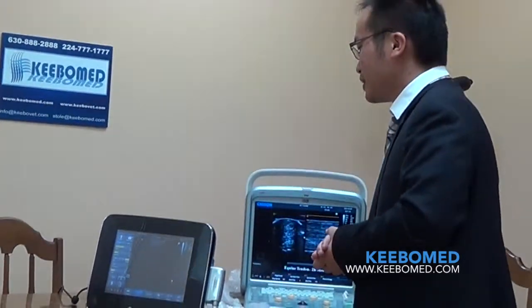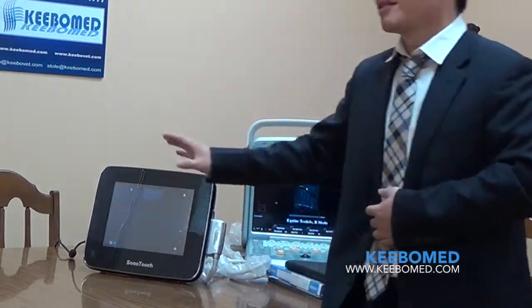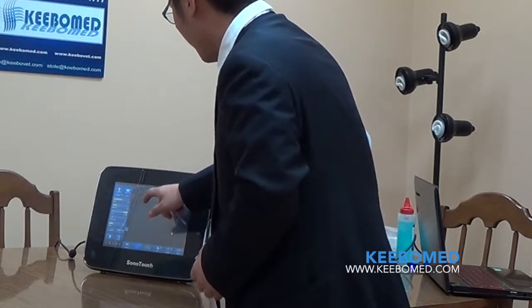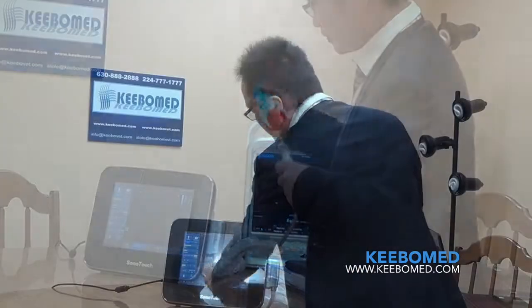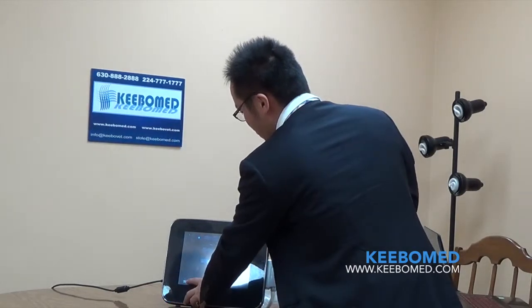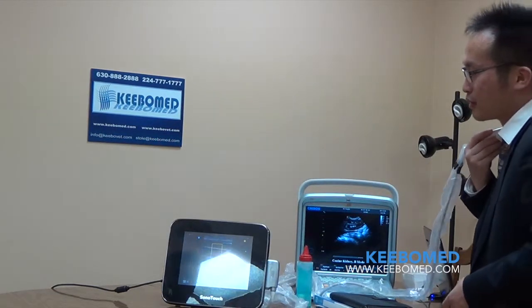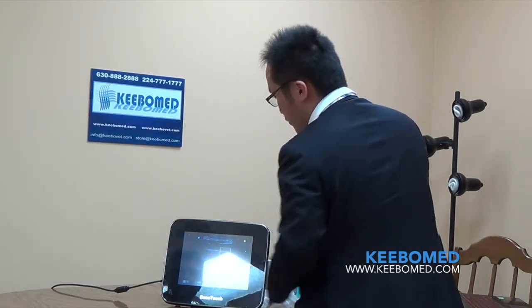For this model, we have a new function called full screen. This is very important for this kind of model. Now let's look at some images — let's apply some gel. There is a small icon here — press it and you can access other functions. For example, if I want to detect color, just press it. Same as B-mode, just hold on it and the box will follow your finger.